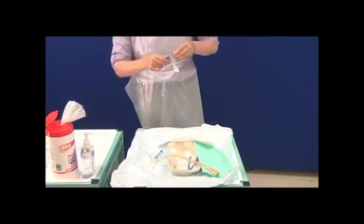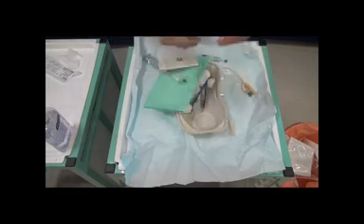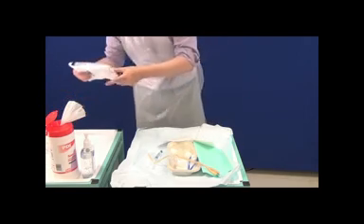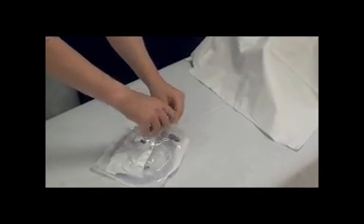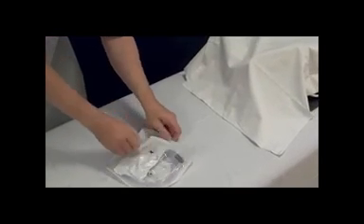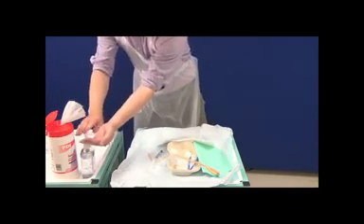Some places advocate cleaning the top of the Normasol with a chlorhexidine wipe, and then pour the Normasol into your sterile galley pot. Check the expiry date on the catheter drainage bag and place that at the end of the bed, ready for use at the end of the procedure. At this point, if your patient or your assistant is going to be unable to help you uncover them, you need to uncover the patient. You won't be able to do this once you've got your sterile gloves on.